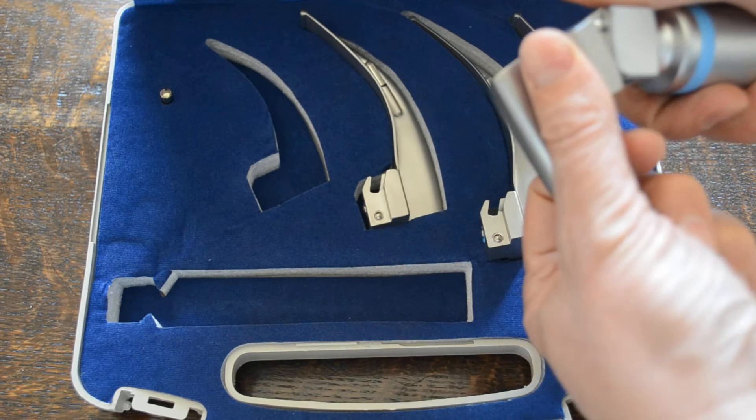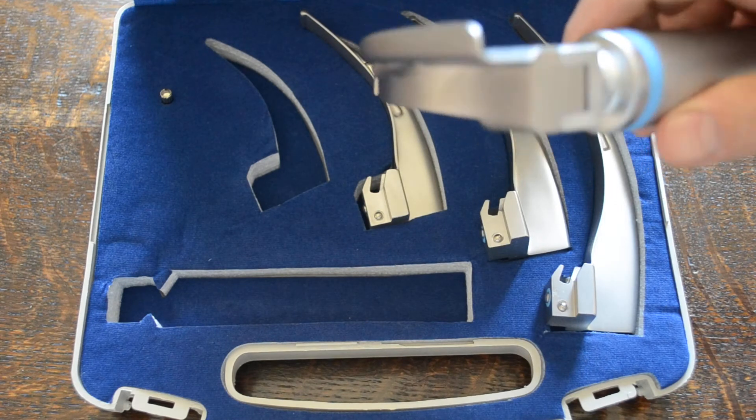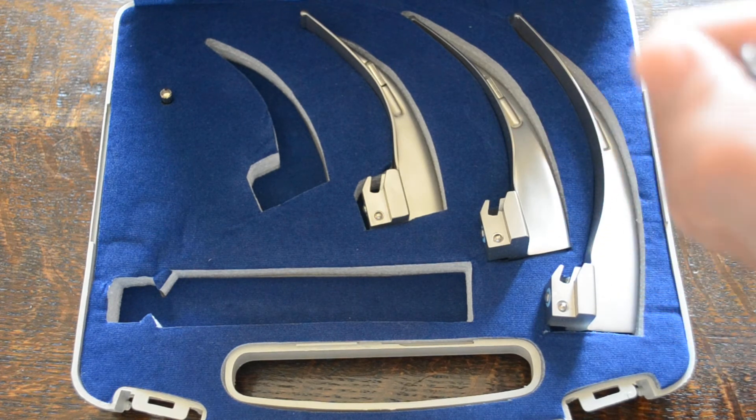Blades clip in and lock down on a nice rigid firm ball attachment. Obviously in that position, with the batteries in, the bright light source is working. Clip out and slide out to be removed.